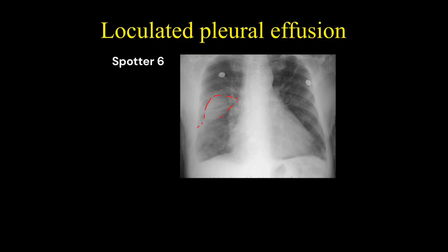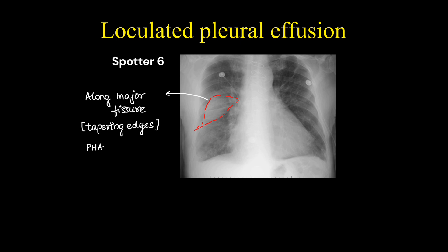This is a common clinical scenario in which we can see loculated pleural effusion along the major fissure. We can see the tapering edges, which show that this is a fissural effusion, also called a phantom tumour. It will also be associated with pleural effusion by blunting of the CP angles.